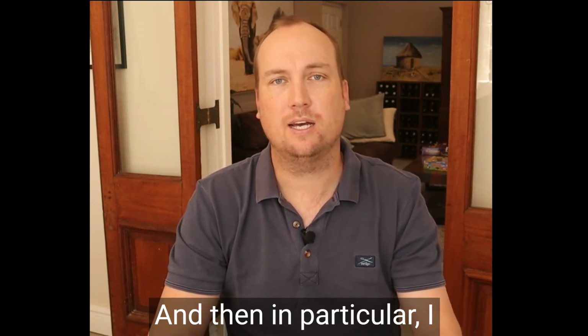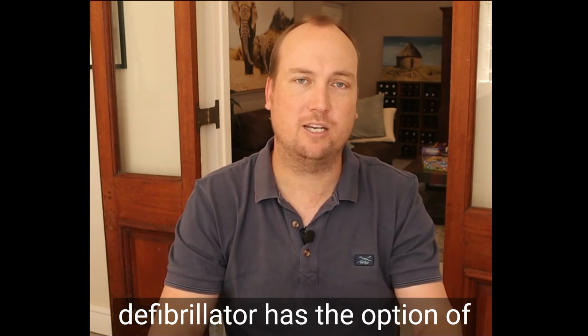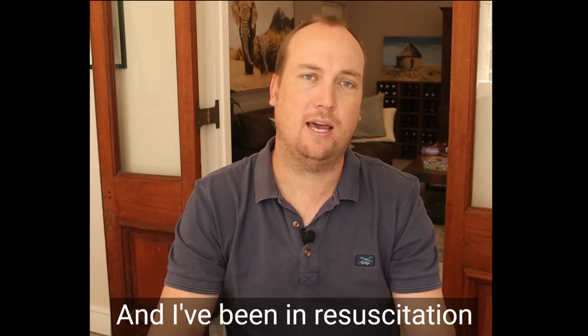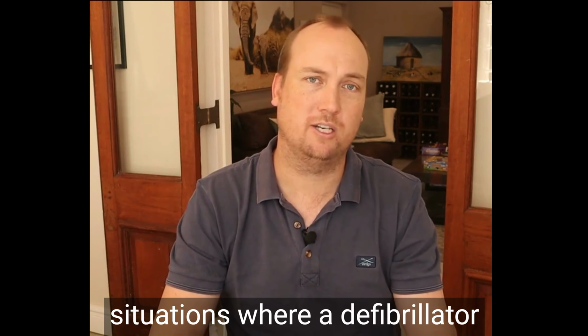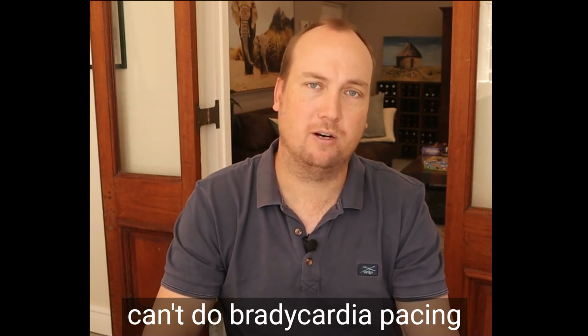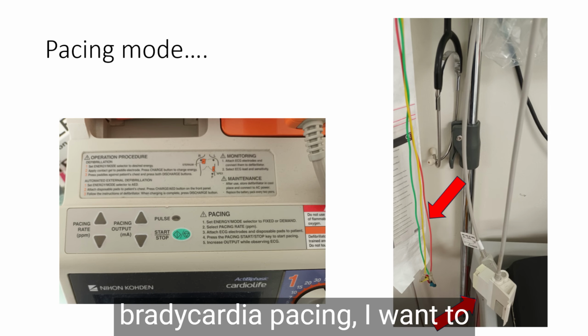And then in particular, I also want to know if that defibrillator has the option of bradycardia pacing, because not every defibrillator has that. I've been in resuscitation situations where a defibrillator has been brought and we can't do bradycardia pacing with that defibrillator. So I want to see that we can do bradycardia pacing.